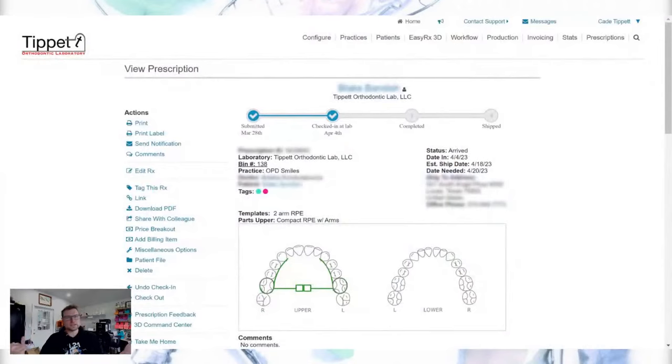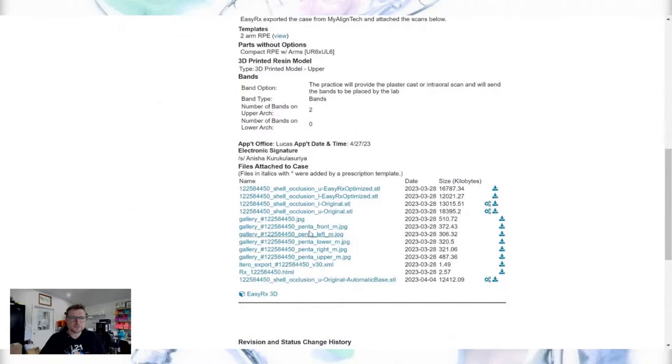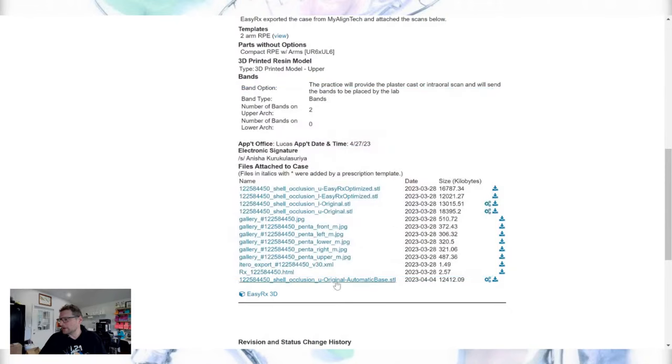This is EasyRx — this is where files come in from the doctors. I've blocked out the name and other info that shouldn't be on the internet. This is a generic prescription and if you scroll down they just want a two-armed RPE, what we call a compact RPE. We have the models here so we can check the upper scan, and we've actually sent this to auto-base.